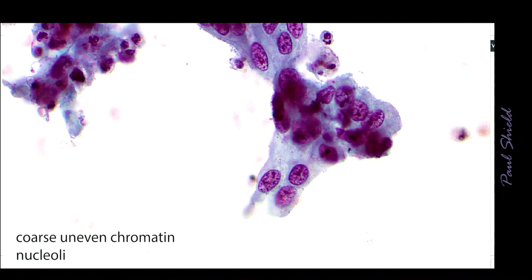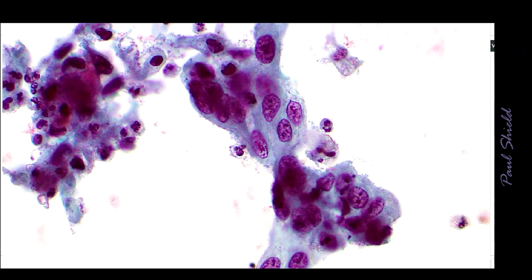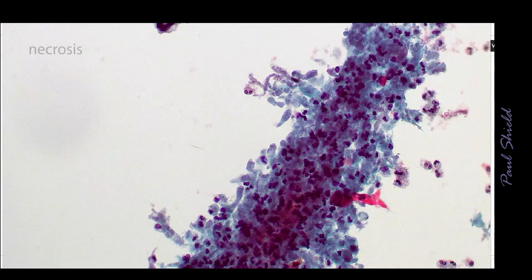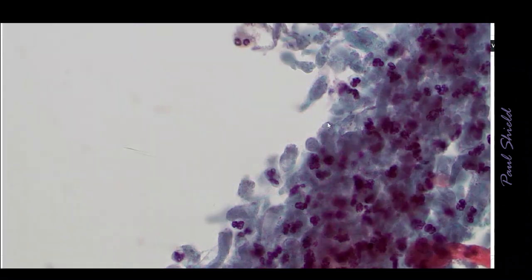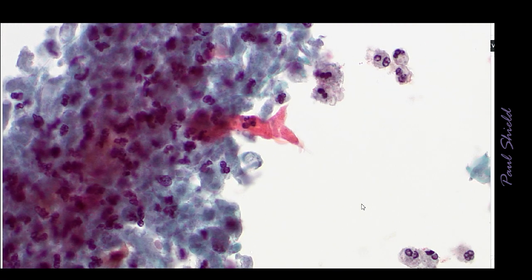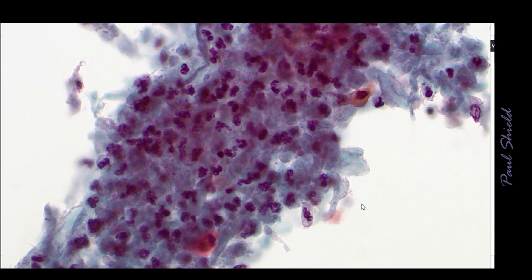This is a really nice example of what look like malignant cells to me. They have coarse irregular chromatin and prominent nucleoli, and those are features of malignancy also that you don't normally see in situ lesions. Another thing is necrosis and a tumour diathesis. This is a big clump of necrotic material, quite common in squamous cancers. And this is made up, if you look at all these bluey grey things, these are dead cells, and the nuclei have faded out of them, so you just have like a ghost of a cell.